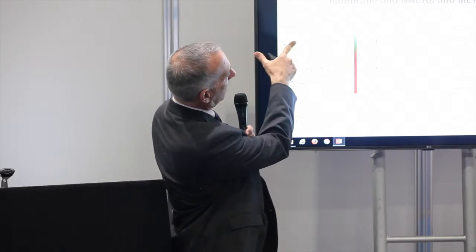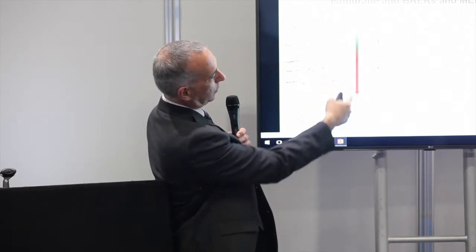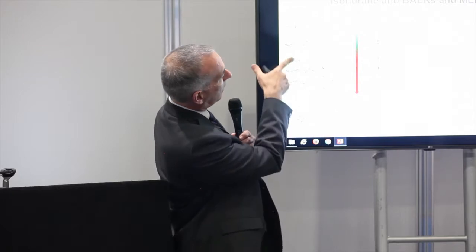Many typical anesthetics that are employed, again, each of them have their own effects on the patient and on the neurophysiology. And what I'm showing here is the different potentials and the effect of anesthetic on them. So I'll try to be Vanna White if you were to watch Wheel of Fortune in the US. So just to give you an idea, starting out with very nice potentials on brainstem responses, and how as you increase the levels of gas, they start to flatten out in this area here.